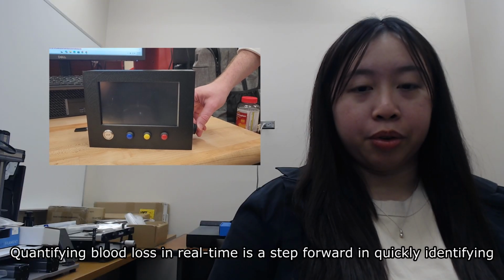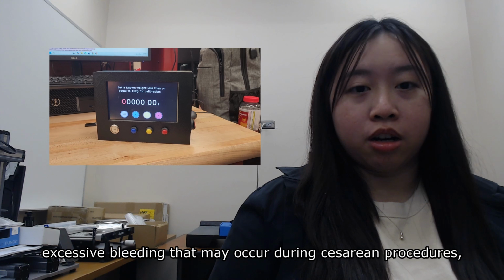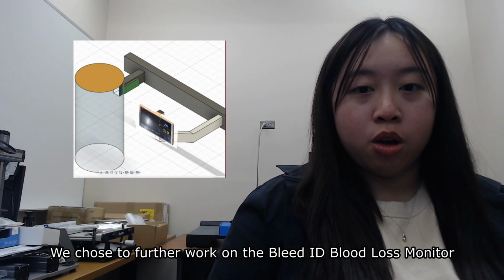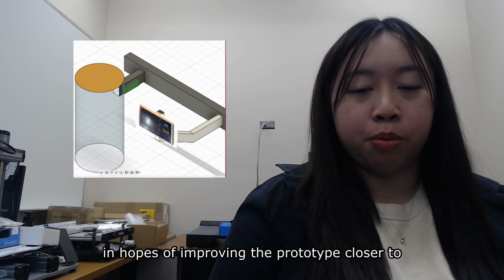Quantifying blood loss in real time is a step forward in quickly identifying excessive bleeding that may occur during cesarean procedures, preventing postpartum hemorrhage from happening. We chose to further work on the Bleed ID blood loss monitor in hopes of improving the prototype closer to commercial use in Orlando Health Winnie Palmer hospitals.